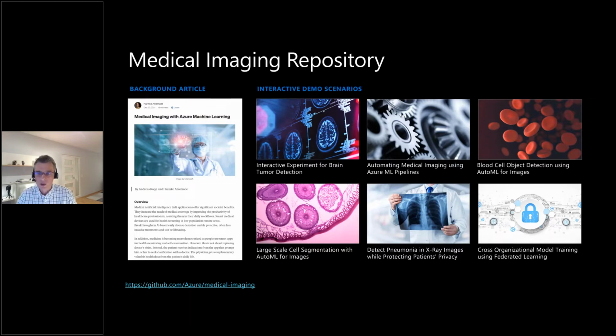And then finally, we have 2 elements included for privacy preserving machine learning. One is about how to leverage differential privacy to protect a model so that it's not possible to reconstruct any PII data from the trained model. And then very important use cases for medical settings is federated learning. So today we are not able to show all of the capabilities that we have, but these 3 are the ones which we want to focus on in the remainder of the session.